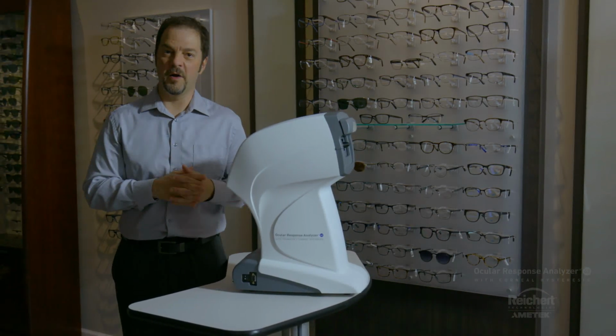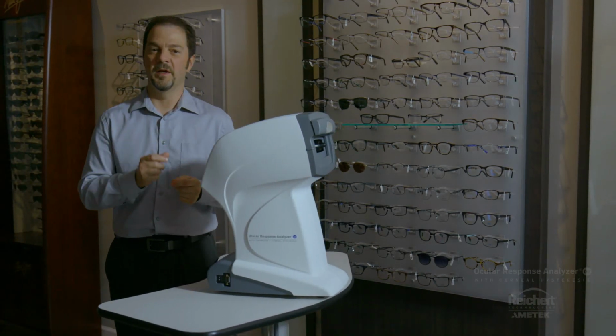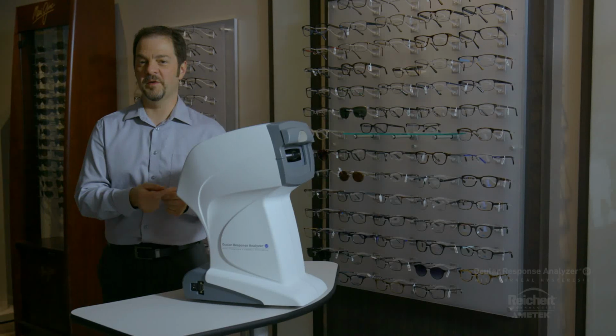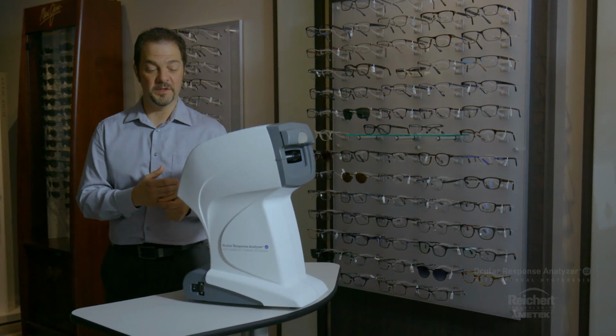There's lots of different EMR systems out there. Most of them at this point in time don't have a field for corneal hysteresis, and so you need to work with your EMR company to try and find a place to put the corneal hysteresis measurement or request that they create a field for that. And we at Reichert are working on that with the EMR companies as well.